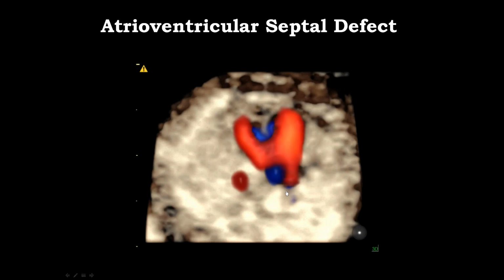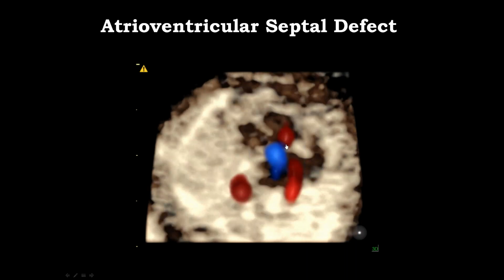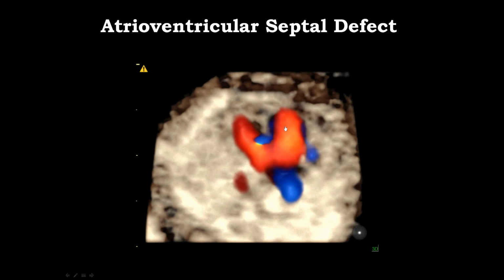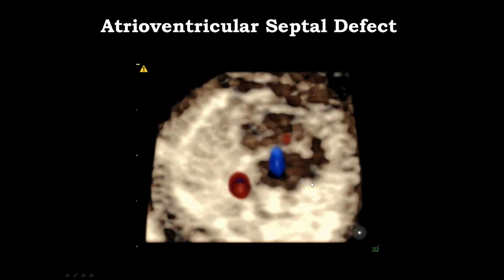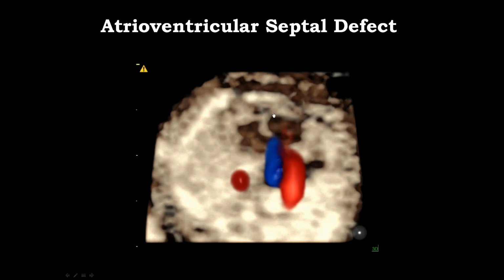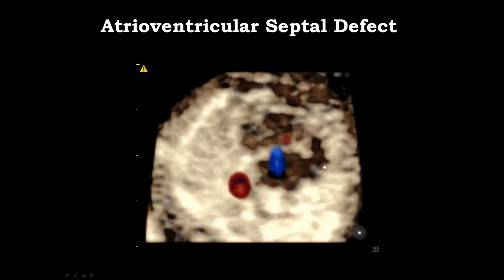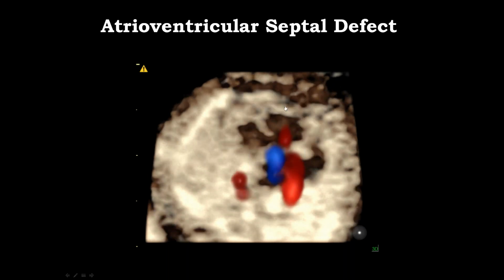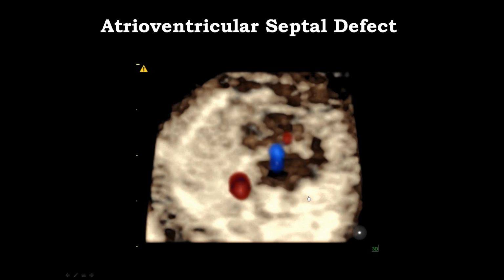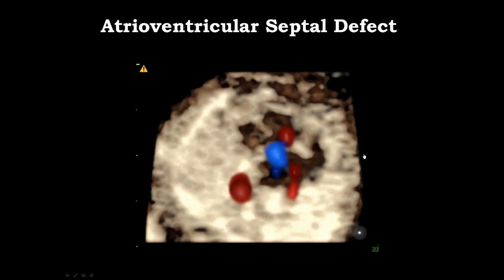And of course, this is a very important technique when we suspect a cardiac anomaly. And here we have the case of a common AV valve and common atrium. And here we have significant tricuspid insufficiency on this common valve. So we can assess all the details of this anomaly. And also an important thing about the 3D technologies, in particular STIC, is that it doesn't take that much time to learn, and it doesn't take that much time to obtain, but all the information about this heart is actually contained in that 3D volume, and you can send that volume to a specialist for a second opinion. So that's probably a very important tool that we can use in addition to our traditional techniques.